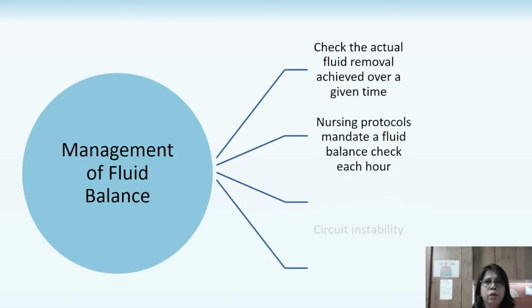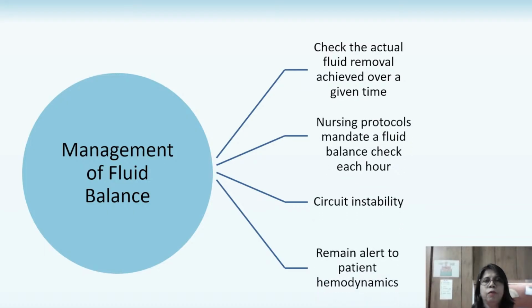And so, in order to prevent such missed opportunities of fluid loss being achieved, many physicians recommend that a higher goal of fluid balance should be set while performing the CRRT. Also, we must remember that there are many machine-based methods which allow the operators to check the actual fluid removal achieved over a given time. Some nursing protocols also mandate that a fluid balance should be checked hourly, especially if there are inexperienced nurses.